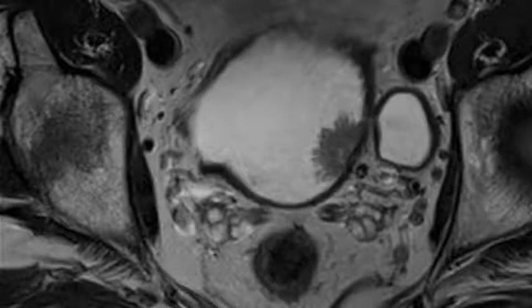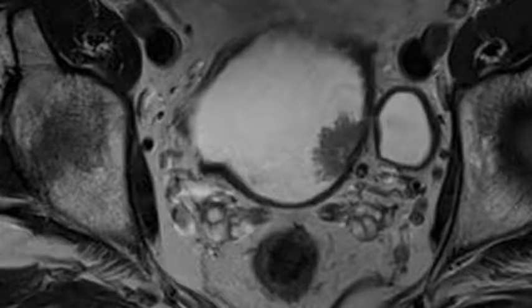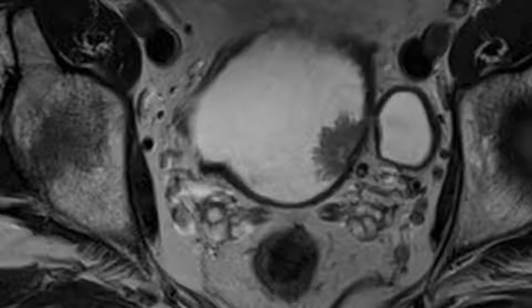Although some small series have shown CT cystoscopy to have a sensitivity of over 90%, it is probable that any additional diagnostic sensitivity is outweighed by the invasiveness of the procedure, the fact that cystoscopy is required for the detection of small flat lesions, and the reduced sensitivity of virtual cystoscopy for dependent lesions, where there may be a pool of urine obscuring the mucosa.